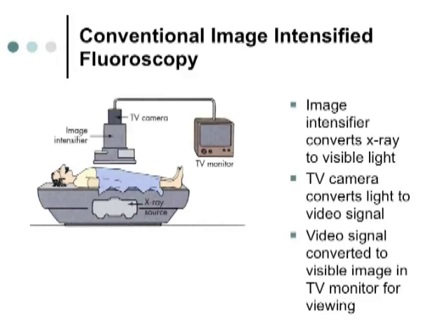Okay, so how does this thing work? Well, we have the X-ray tube located below the tabletop. Above the patient is our receptor. It's kind of like what you would use for your film or your digital plate. The receptor is the image intensifier. Compared to the old plate that we had over the patient on the old fluoroscope, which was made out of calcium tungstate, the X-ray went through the patient, the fluoroscope fluoresced, gave off light, and then they looked directly at that fluorescent screen.